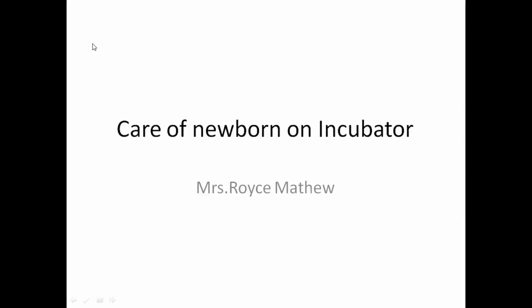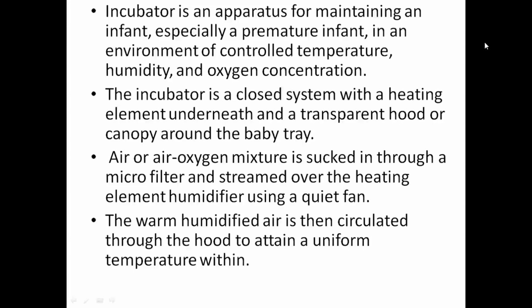Good morning students. Today in class we will see about the care of a newborn in an incubator. An incubator is an apparatus for maintaining an infant, especially a premature infant, in an environment of controlled temperature, humidity and oxygen concentration. The incubator is a closed system with a heating element underneath and a transparent hood or canopy around the baby tray.